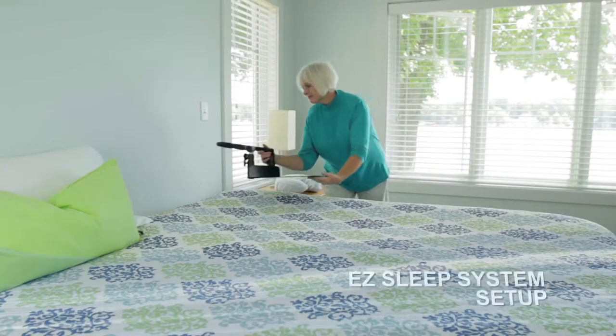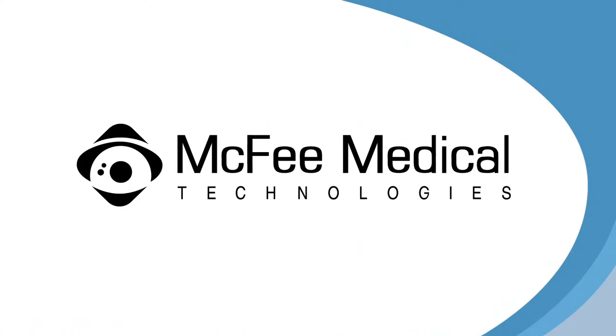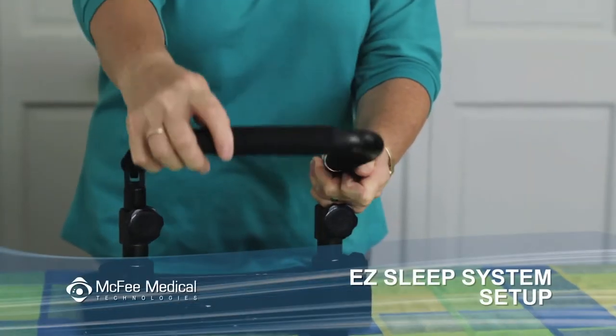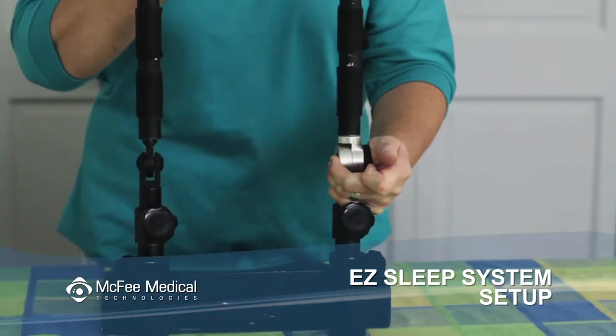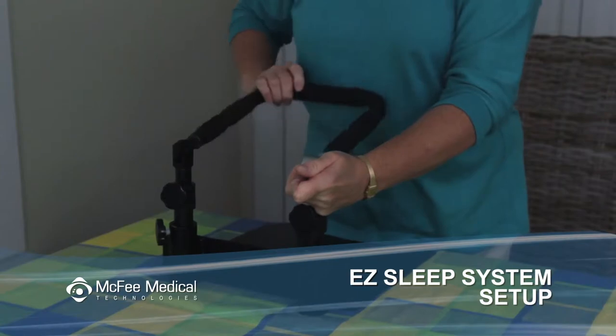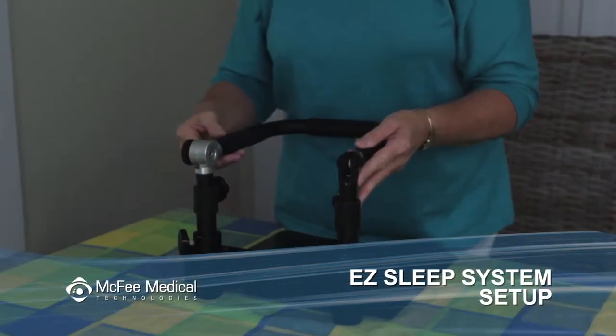Now place the face support base on the mattress at the head of the bed. The U-bar will need to be positioned away from the base plate. This can be accomplished by depressing the black knob on the lock and rotating the U-bar to the correct position, or by lifting the U-bar out of the cylinders and turning it in the opposite direction.